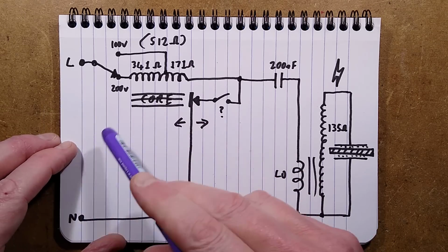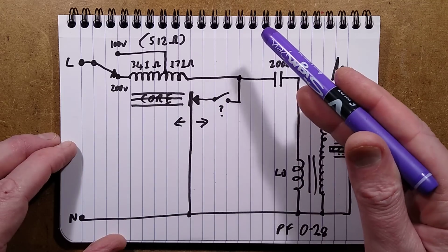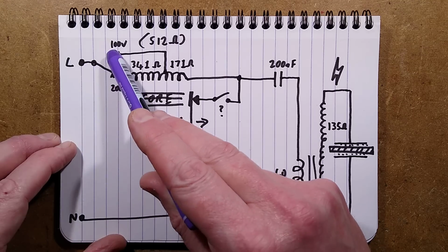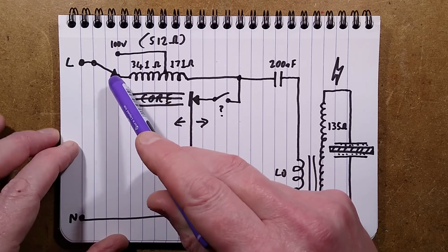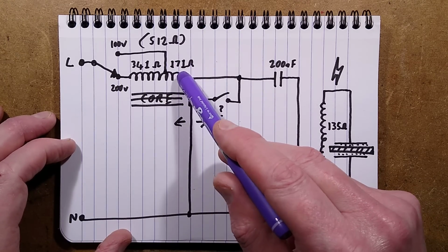Live comes in, AC or DC apparently, and it can switch between these two connections. There's no on-off switch over there, it's over here, and it's a bit strange how they've implemented that. It's a very strange thing indeed. So the live can switch with the link system, a nice solid link between the 100 volt supply or your 200 volt supply. If you put it to 100 volts, it's 171 ohm impedance on that coil.